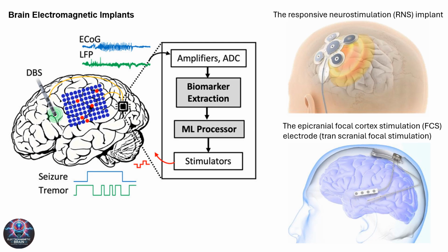Using the power of wireless technology, BCIs have the potential to restore lost functions in patients with neurological disorders, such as those with spinal cord injuries, stroke, and neurodegenerative diseases. This advancement paves the way for real-time brain monitoring, the development of neuroprosthetics, and even direct brain control, offering exciting new possibilities for neurorehabilitation and the enhancement of human capabilities.